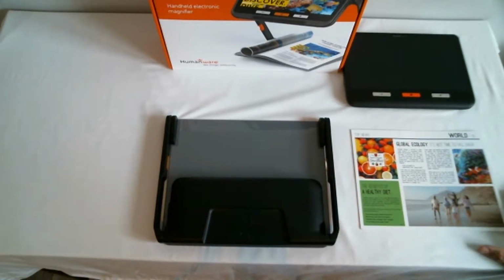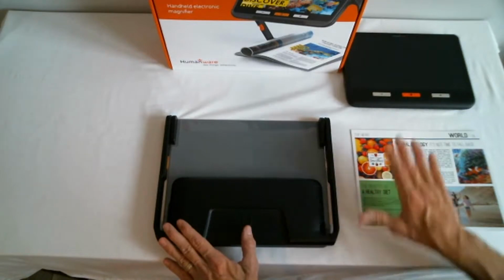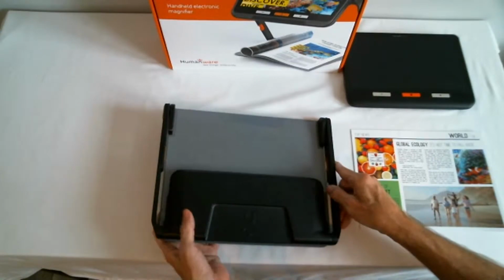Today, I would like to show you how to use the optional folding stand for your explorē 12. So that's what we see here at the center of the table, along with a reading document and so forth. So the folding stand weighs about 2.5 pounds.